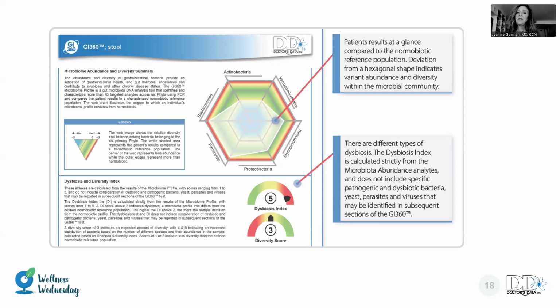And we would like it to fit inside the green shaded area. So that green shading, green is normal biotic. There is low normal, mid-range normal with a sort of a gray bar inside, and then high normal. So anything in green is normal biotic. On both sides of the green is yellow. Yellow would be 1 standard deviation away from normal, either high or low. The red would be 2 or 3 standard deviations away from normal, high. And then there's blue in the center that is 2 or 3 standard deviations too low. So that is how to read this hexagon.